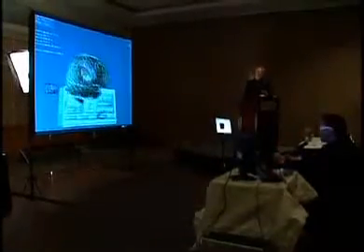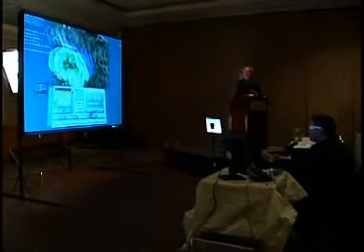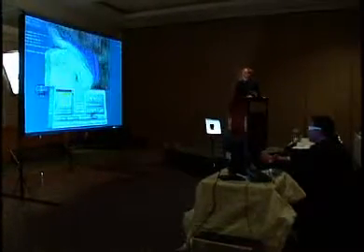I think the possibility, and I'll put myself out on a limb, is that if you have this type of imaging and you can connect it into the stealth station, you may not really need to do cortical mapping. You may have an idea already, know exactly where the tracks are going to be visually, both in terms of knowing where the sensory and the motor cortex are on the surface, and also where the descending tracts are in the depth as you try to remove this tumor.